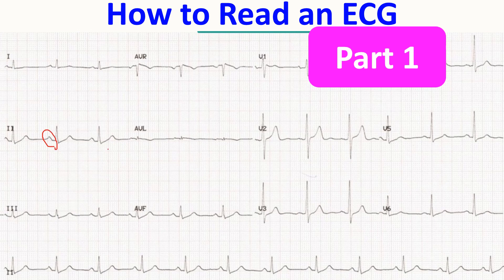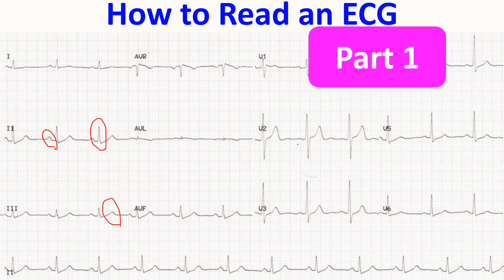This is the P wave on ECG, this is the QRS complex, and here is the T wave — the primary waves seen in the ECG. This region is the PR interval, this is the ST segment, and from the beginning of QRS to the end of the T wave, that is the QT interval.